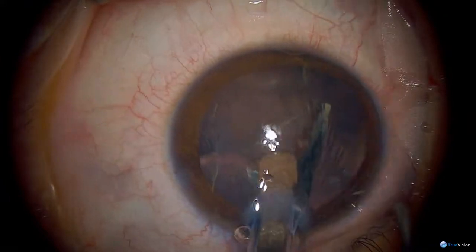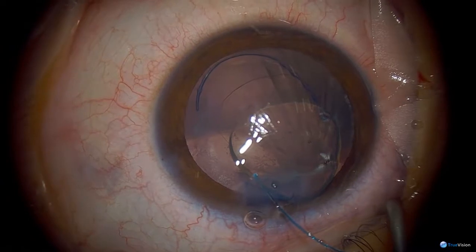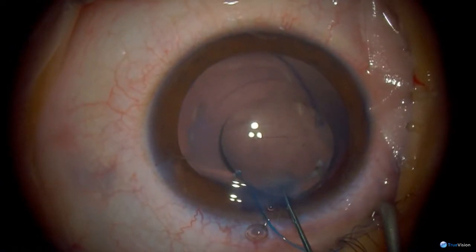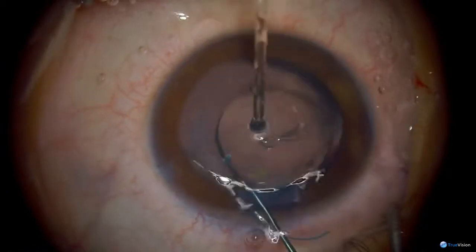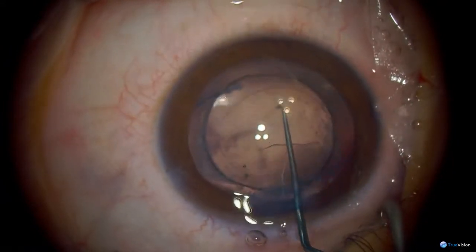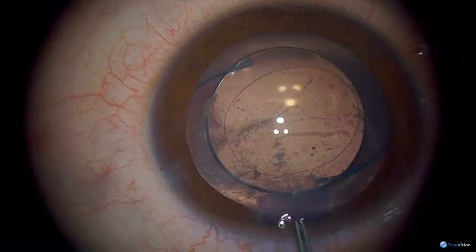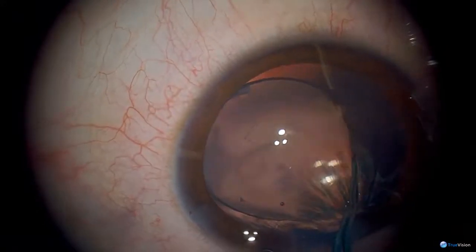The leg needs flipping over. And then I'll have the rhexis forceps please. This is a little bit tricky because you've got to go under the lens. Extending that rhexis.